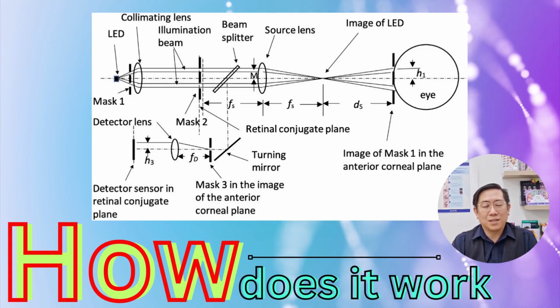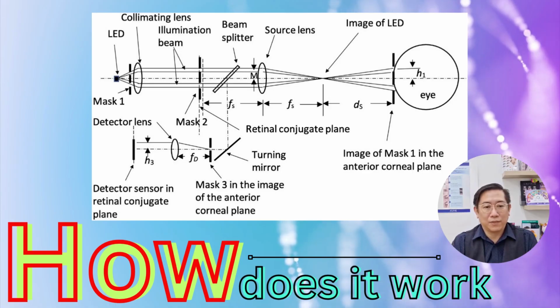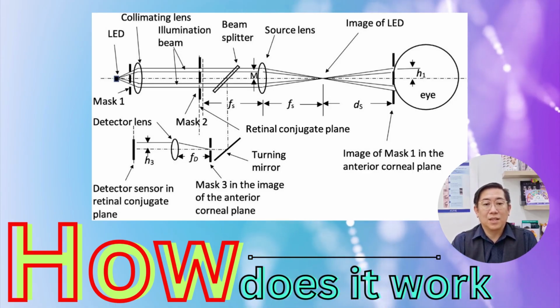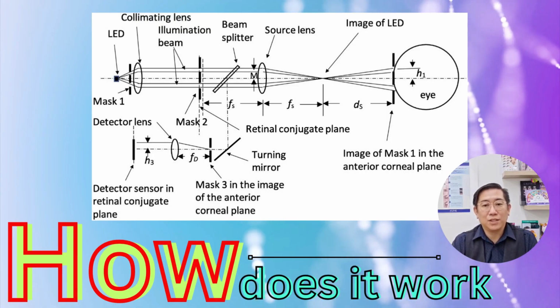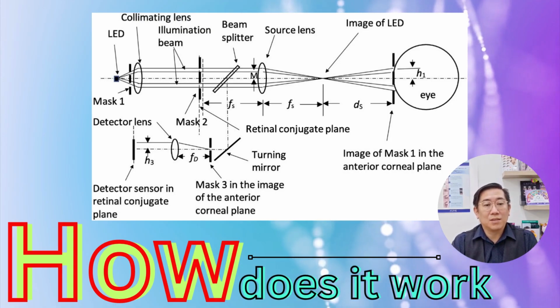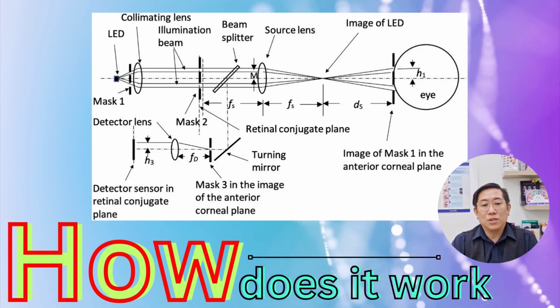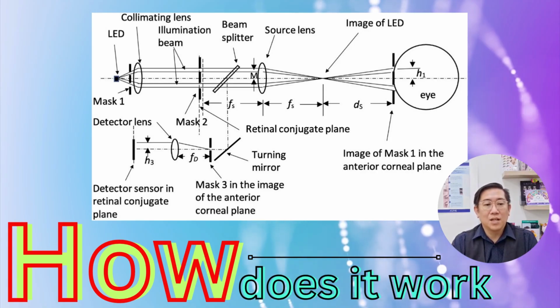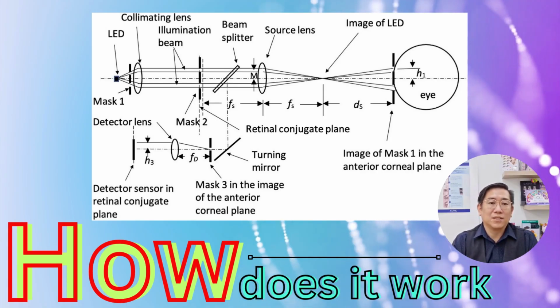There are several modern variations of autorefractors. One, the open-field autorefractors. It allows natural viewing conditions, reducing accommodation errors. Second will be the wavefront-based autorefractors. It uses Shack-Hartmann sensors for high-precision imaging of minor optical imperfections.